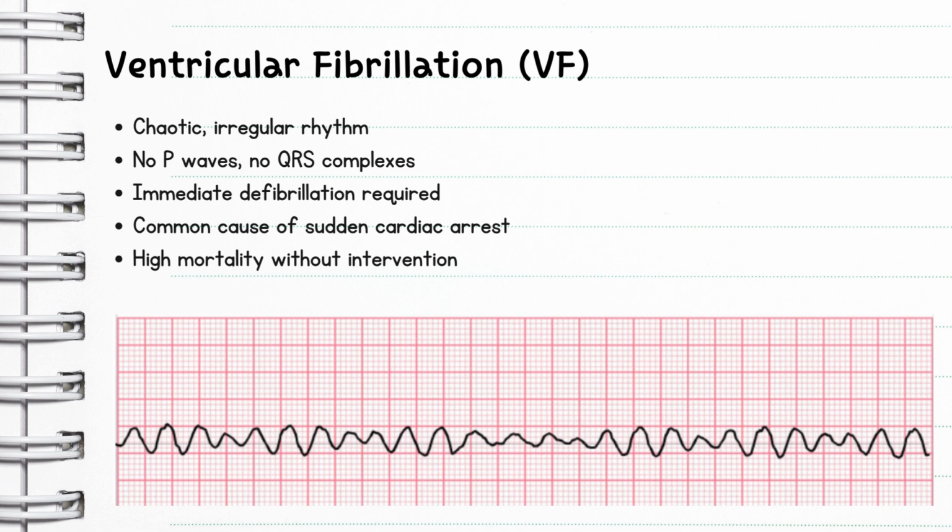Okay, this is not a let's turn around and walk away. This is a do something. Okay, so VFib is the most common cause of sudden cardiac arrest, and time is absolutely of the essence. As a nurse, our role is to recognize this immediately, call for help, and prepare for defibrillation. The survival rate drops significantly every minute defibrillation is delayed, so act fast. Now, I'm going to note on this, okay? You need to defibrillate this person ASAP.